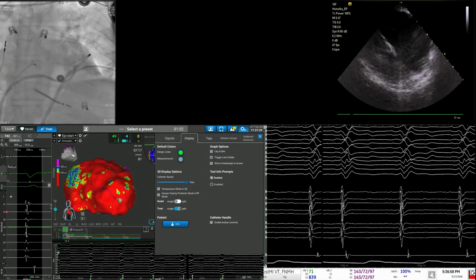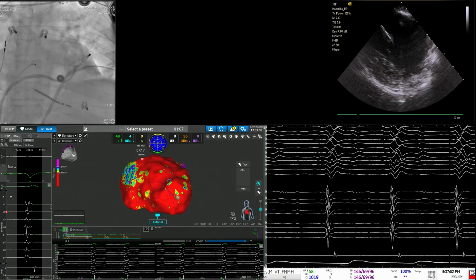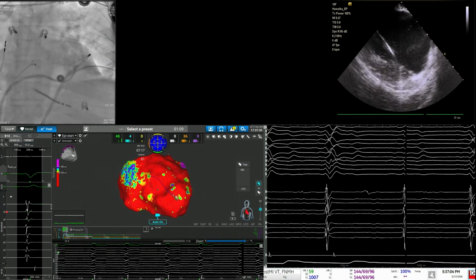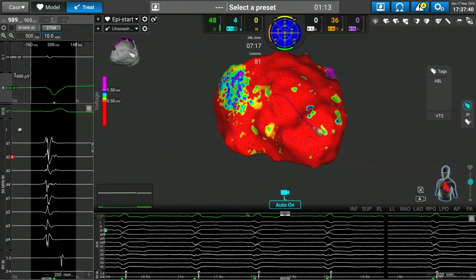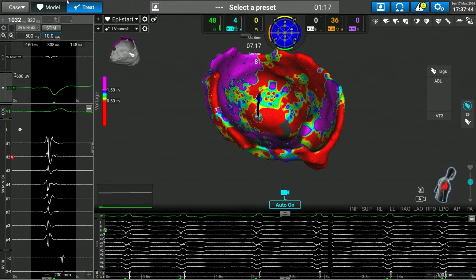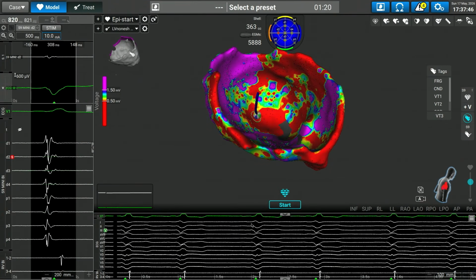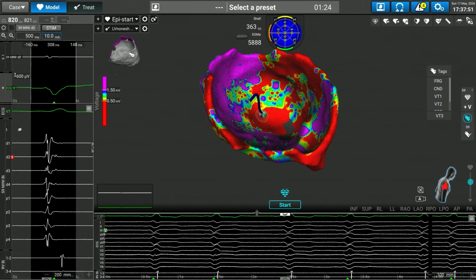So let me just tell you what we did. We'll start off with, as you know, we got pericardial access just before we left. We mapped the epicardium. Now, we're looking from the outside, which is obviously worthless because that's the part that's not touching the tissue. So we have to flip it around and look from the inside. So let's look from the inside, guys. And you can see that there's this apical region. And I'm not going to show you the electrograms in the interest of time.